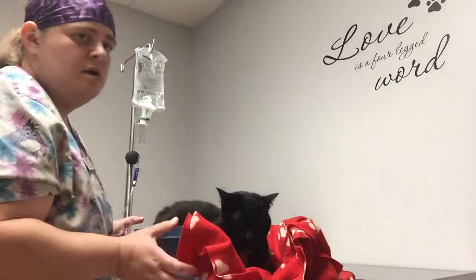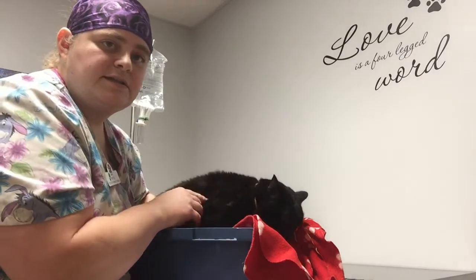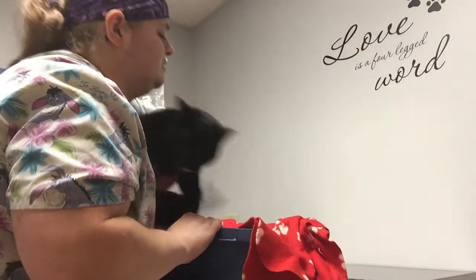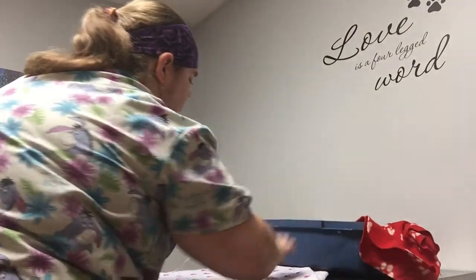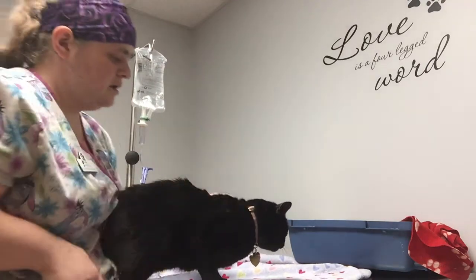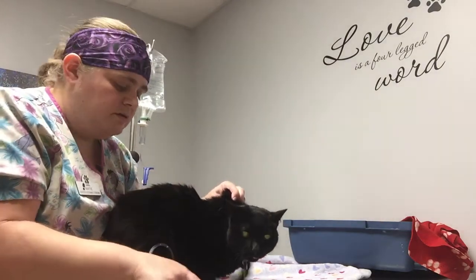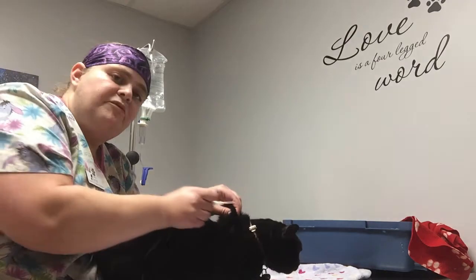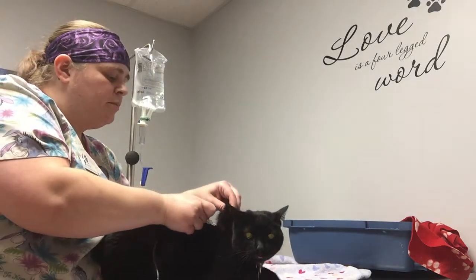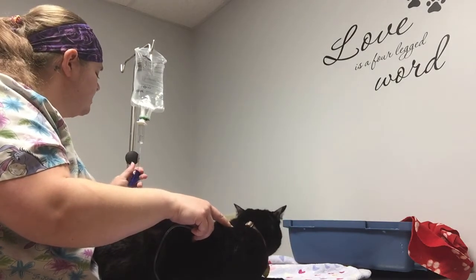When we do subcutaneous fluids, we like to do them between the shoulder blades and make a little tent of skin right there — that's where we're going to poke. Lift up so there's a little tent, uncap your needle, and aim forward so you're not poking downward — you don't want to hit anything important. Then poke the needle in and unroll the clamp so it gives fluids.